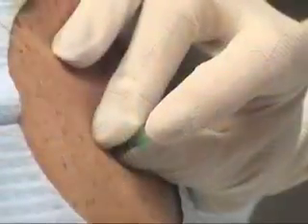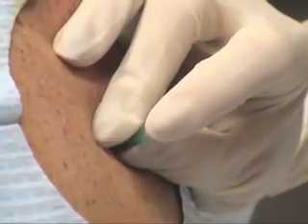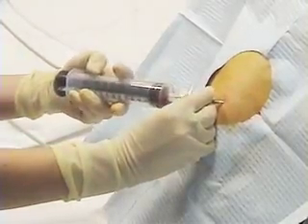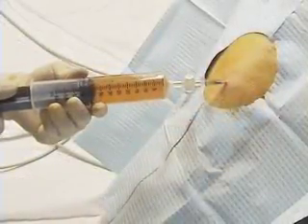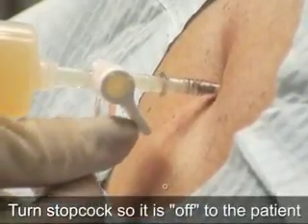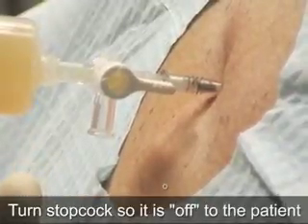The exposed hub of the catheter should be covered immediately with your finger to prevent the entry of air into the pleural space. Next, attach the three-way stopcock and large syringe to the catheter and continue to aspirate fluid. When this syringe is full, adjust the stopcock so that it is closed to the patient. The stopcock should be open to the patient only when fluid is being actively drained.